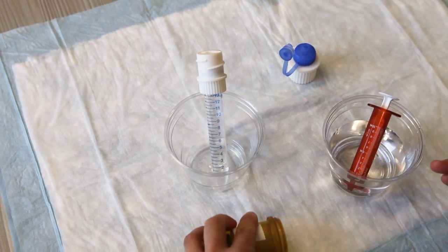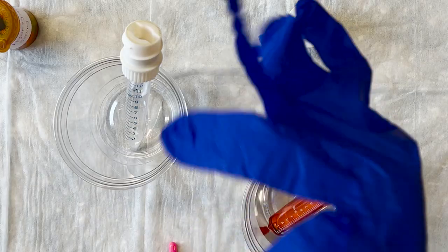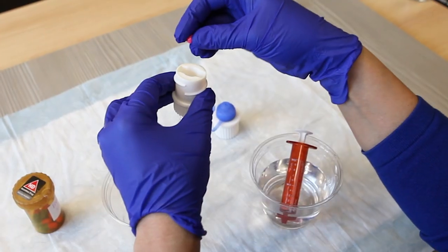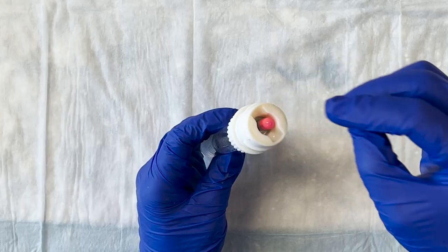Screw the adapter body from the capsule shredder onto the tube and place it in the empty cup. Open the medicine bottle and remove a capsule. Put the lid back on the bottle as soon as possible. Next, put on the gloves. Place the capsule horizontally into the rectangular hole — it should fit easily. Do not place it in vertically.